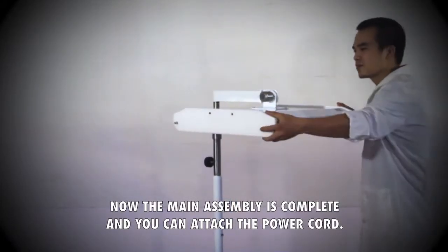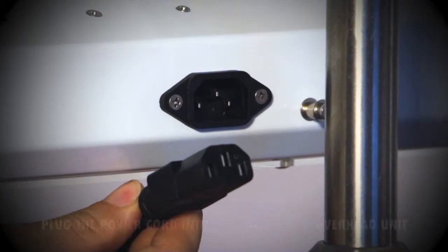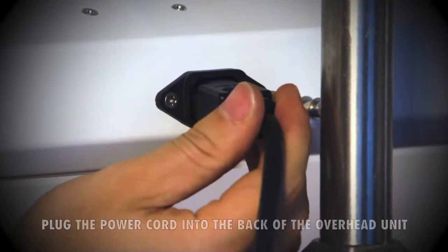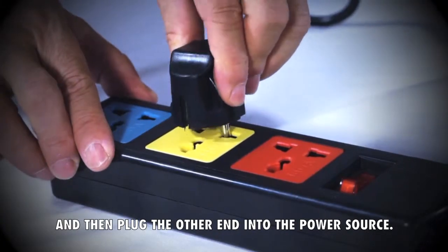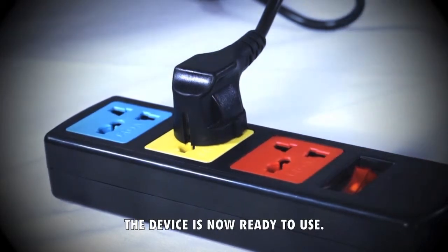Now the main assembly is complete and you can attach the power cord. Plug the power cord into the back of the overhead unit, and then plug the other end into the power source. The device is now ready to use.